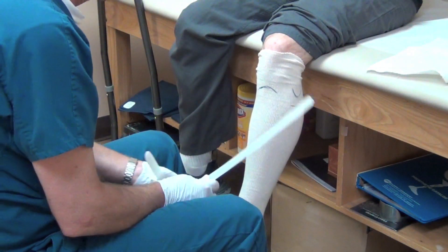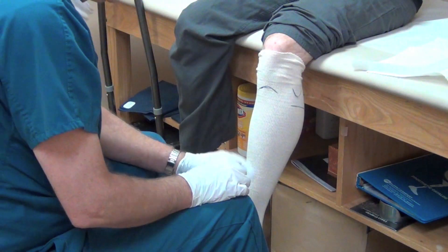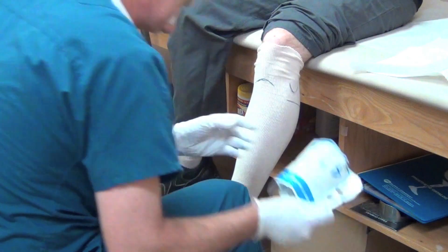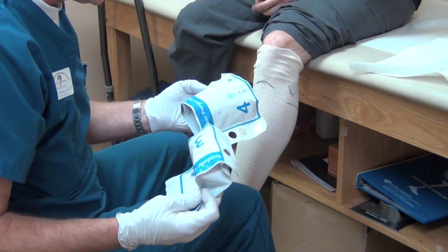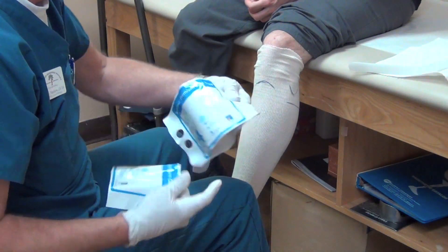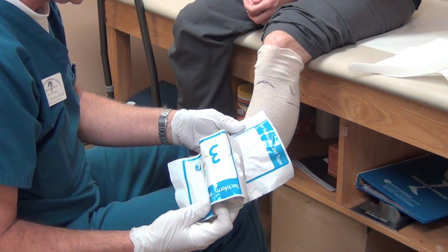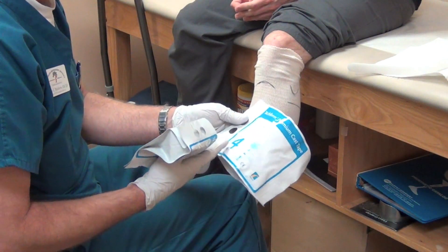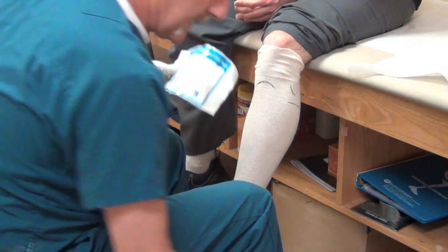With adult patients, the vast majority, I use a 4 inch and a 3 inch — I use the Tech Form. There are other good materials out there, but I find these are relatively inexpensive: about $42 for 4 inch, $32 for 3 inch.